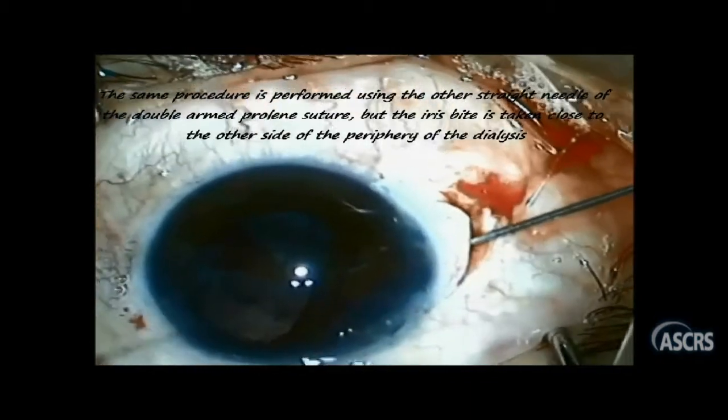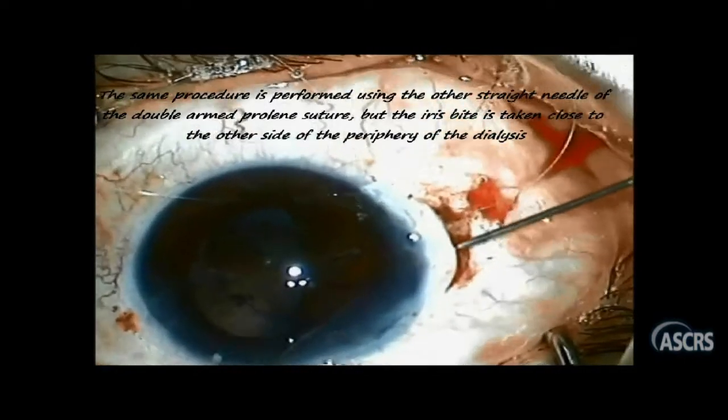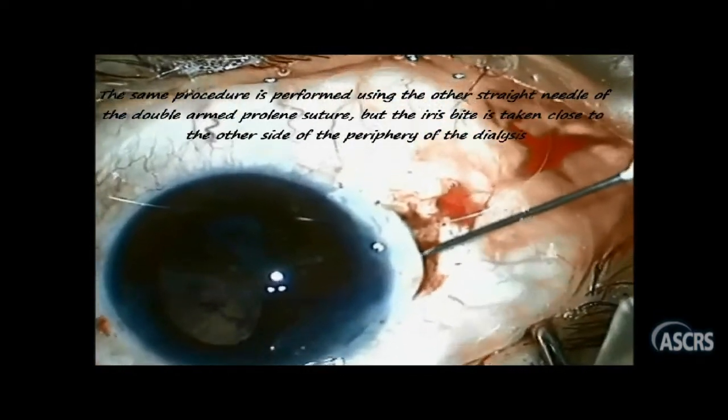In the same way, the second needle is introduced through the cornea, then through the upper end of the dialysis, and finally guided to come out under the scleral flap.